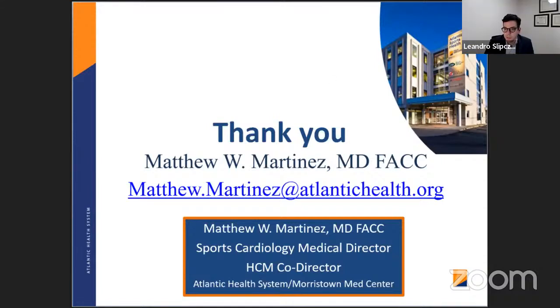We have a question from Mark Menegos now. It's about following a marathon runner in his 50s with bicuspid aortic valve and moderate AI. I followed his echo for decades, no change in dimensions and no symptoms. Should we have a baseline CMR? So I would, for a couple of reasons. One, I think it'll help you with the valve disease for sure. I still think we're learning more about volume assessment by MRI, especially with valvular heart disease. So I think it's really important to get a baseline for this individual.